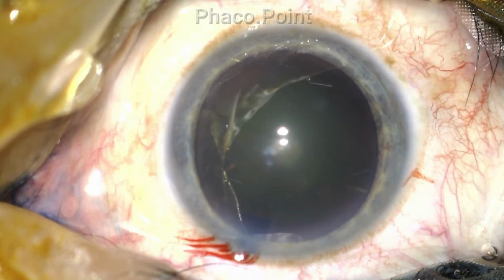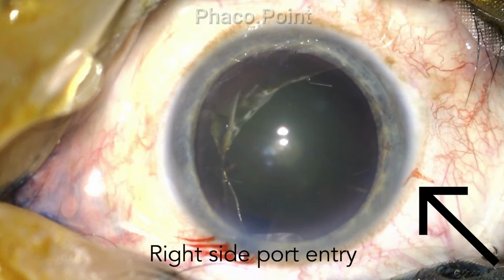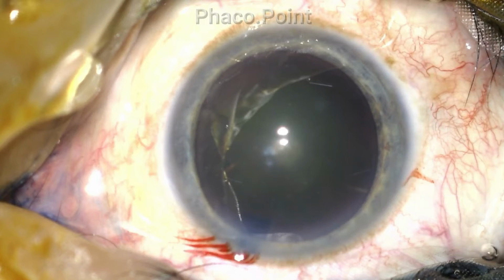So my choices now are, do I go from the same main incision, which to me would not be very comfortable? Should I go from the left side port, which would be far too close to the tear? I always prefer to overcome such a challenge by starting at a point as far away from the point of the tear as I can, to give me that little leverage to be able to now hold, negotiate and turn the tear around. So here's the plan.